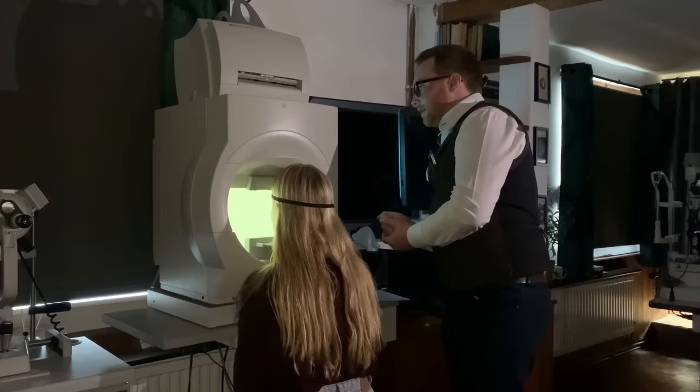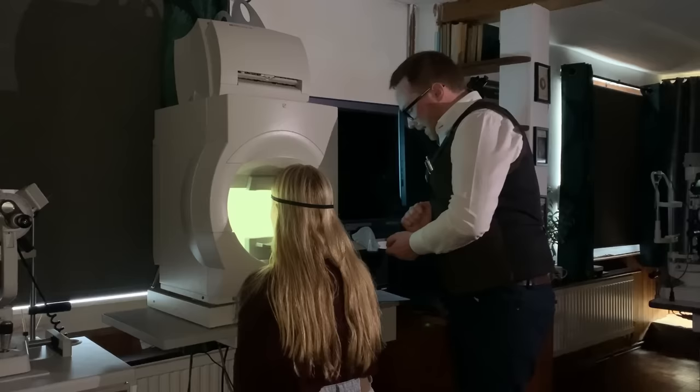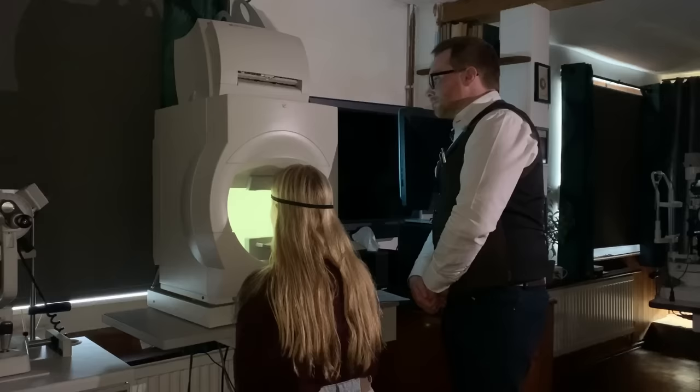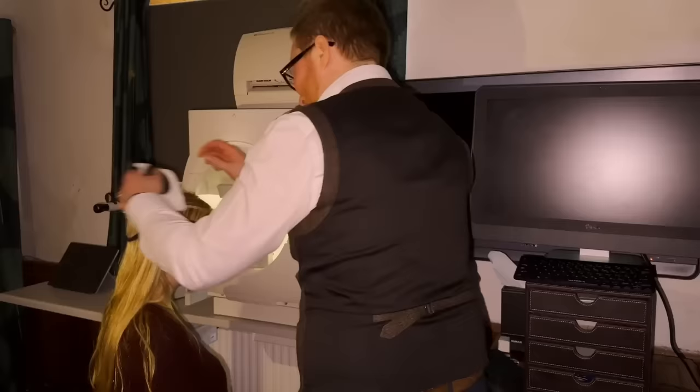So keep looking at that orange one. Nice and still there. Keep looking at the orange one. It's nearly ready to go. And off we go, just pressing whenever you see a little white flash for me. There we go. Thank you. I'll take that clicker for you, and we'll relieve you of your eye patch. Okay. Perfect. And I'll just get all those results saved.